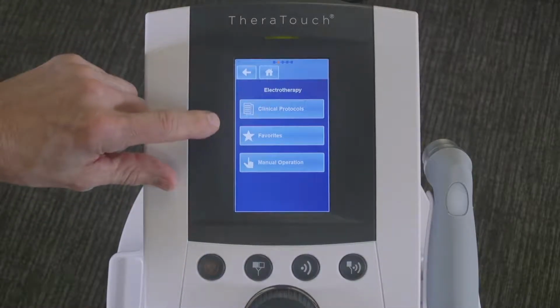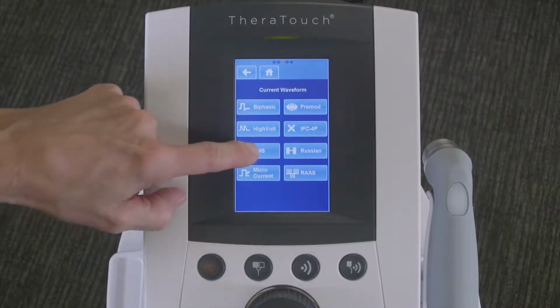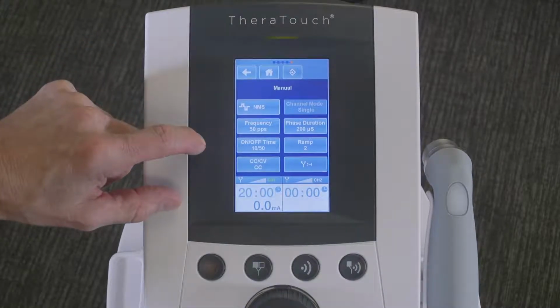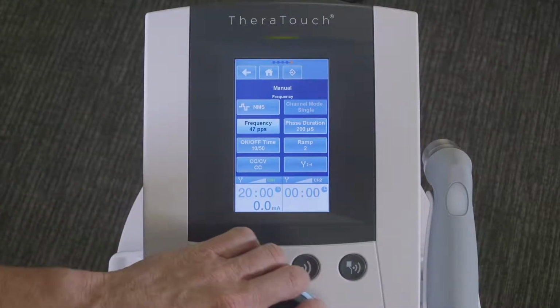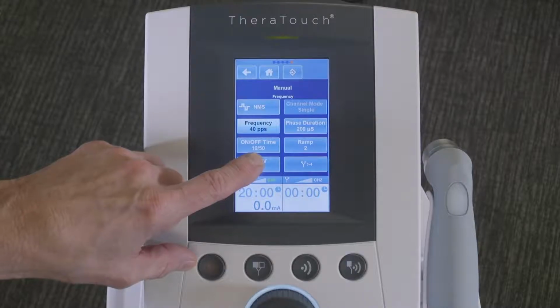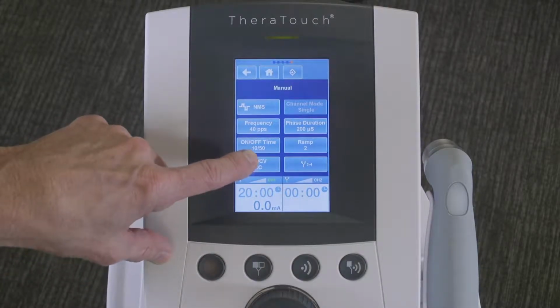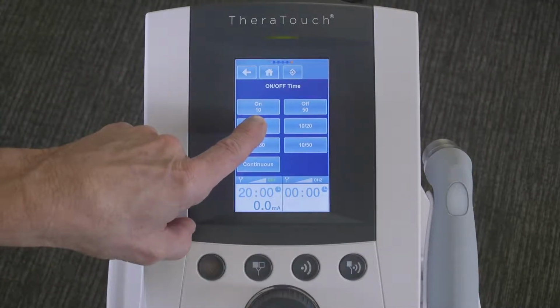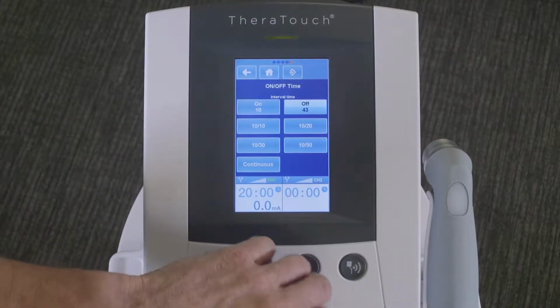You're going to select electrotherapy, manual operation, NMES, the appropriate channel that you'll be using, in this case channel 1, and we want to make sure that the frequency is adjusted to 40 pulses per second. The phase duration set to 200 microseconds, which is already defaulted, and an on-off time of 10 seconds on and 20 seconds off. You can see that we already have the default set at 10 for on, so we want to adjust the off time to 20 seconds.